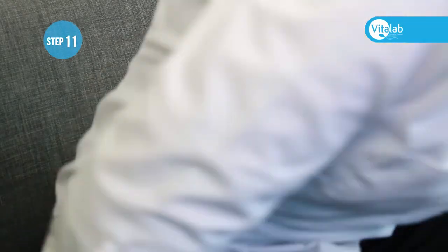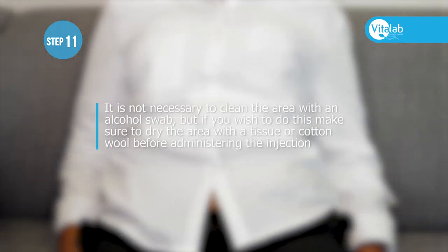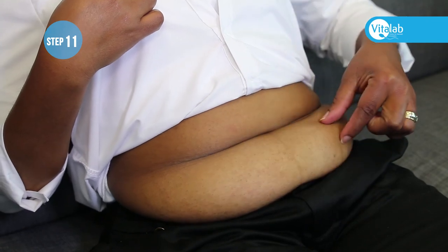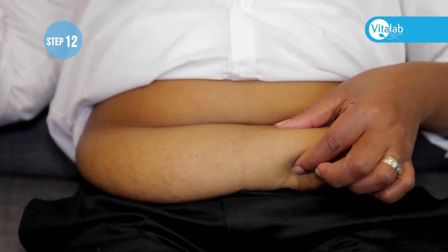The best position for administering an injection is to sit in a chair and lean back comfortably. It is not necessary to clean the area with an alcohol swab, but if you wish to do this, make sure to dry the area with a tissue or cotton wool before administering the injection. The injection can be administered anywhere in the abdomen in the area below the belly button — support the flesh between your thumb and finger, but do not squeeze too hard.